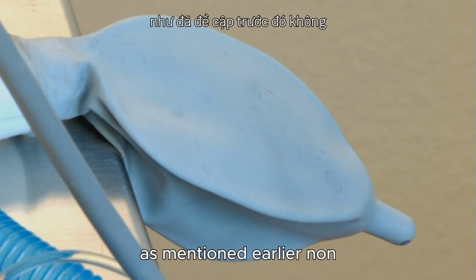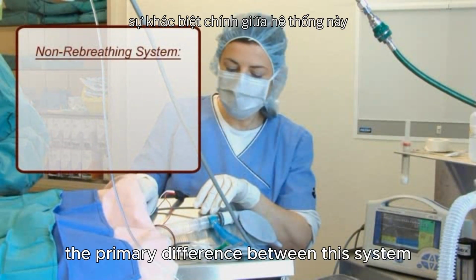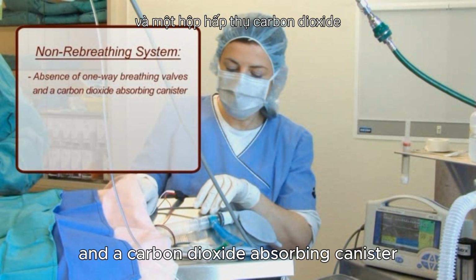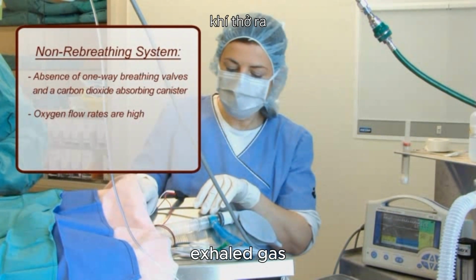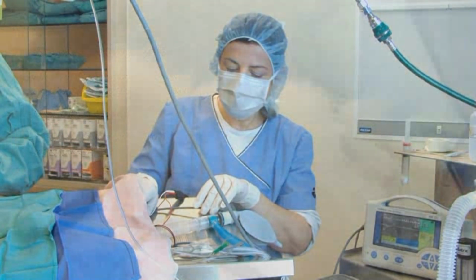As mentioned earlier, non-rebreathing systems are commonly used on animals under 15 pounds. The primary difference between this system and a rebreathing system is the absence of one-way breathing valves and a carbon dioxide absorbing canister. The oxygen flow rates are generally greater in order to prevent the patient from rebreathing exhaled gas. Once the exhaled gases leave the patient, they are routed into the scavenger system and are not recirculated.